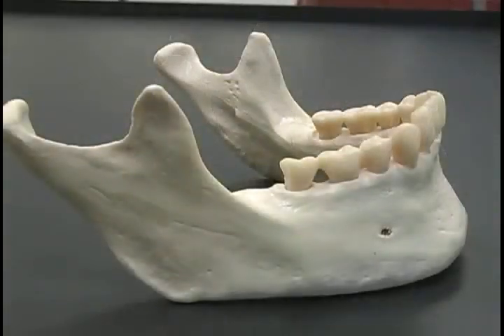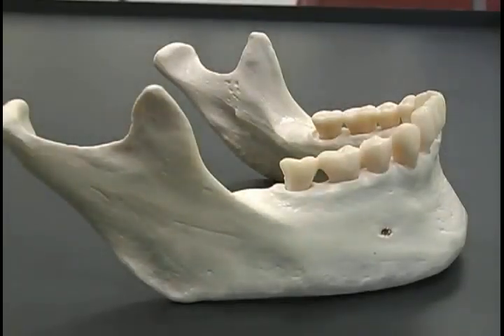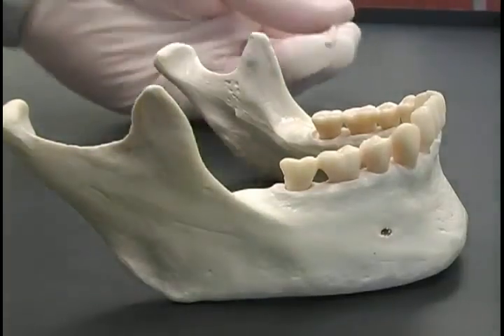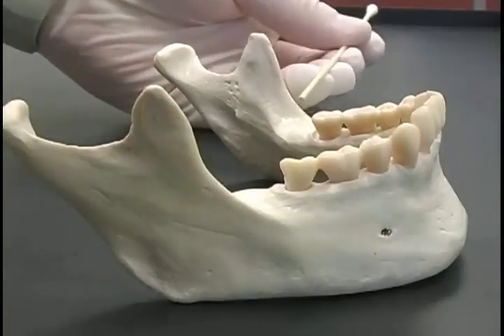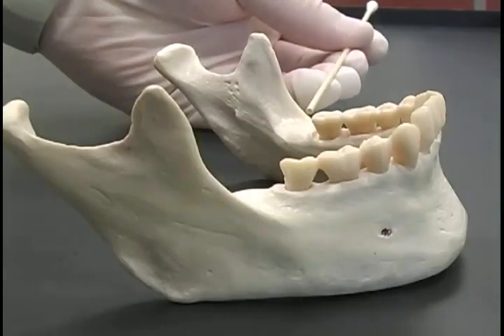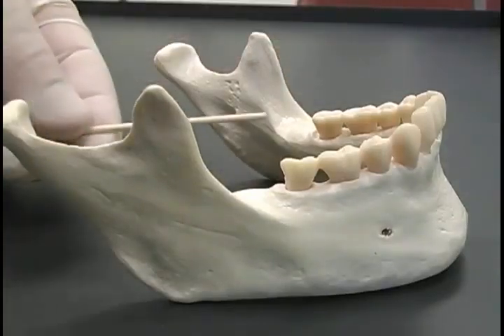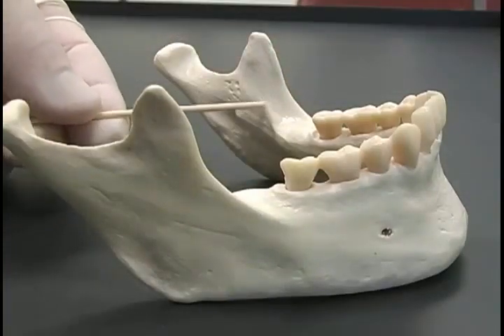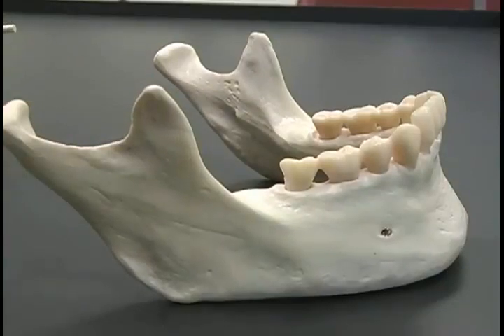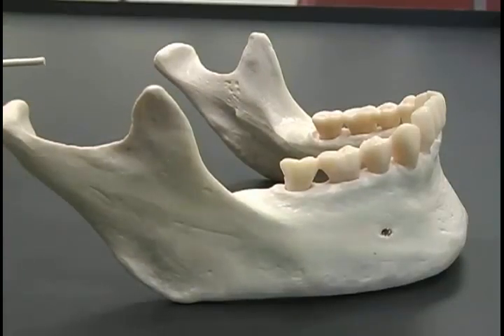When giving inferior alveolar nerve anesthesia, it is important to have good anatomical landmarks. An important anatomical landmark is the external oblique ridge, which can be found on every patient. The internal oblique ridge is much more difficult, and using the pterygomandibular raphé can sometimes lead to giving anesthesia in not precisely the right location.